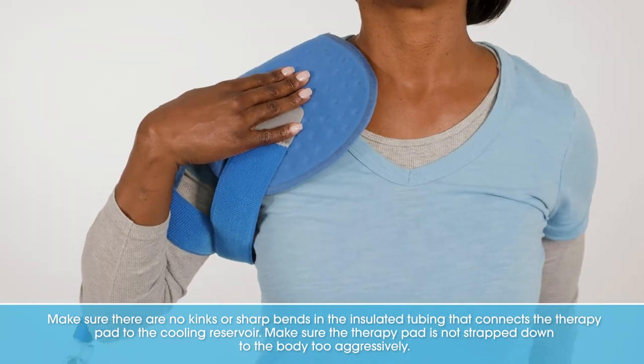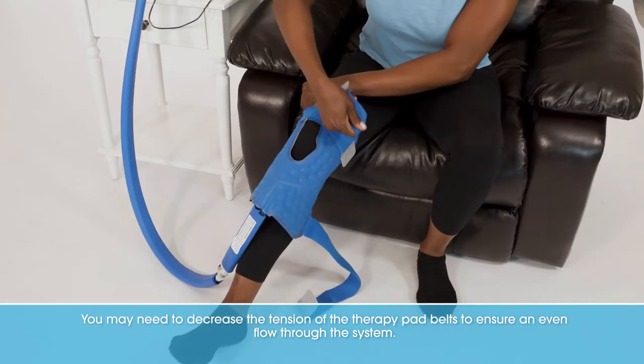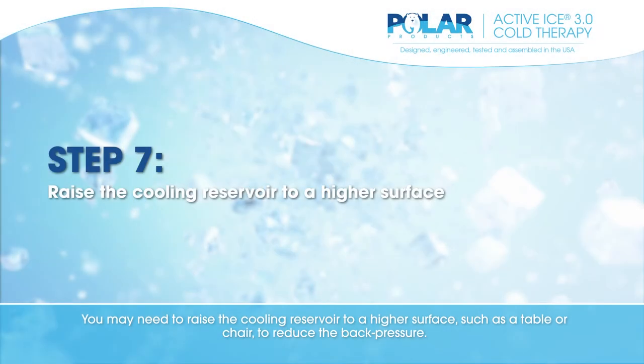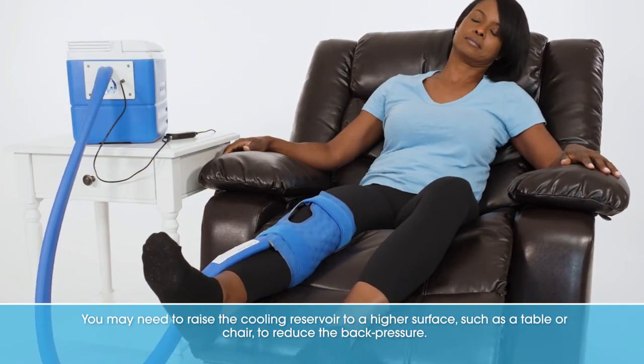Make sure the therapy pad is not strapped down to the body too aggressively. You may need to decrease the tension of the therapy pad belts to ensure an even flow through the system. You may also need to raise the cooling reservoir to a higher surface, such as a table or chair, to reduce the back pressure.